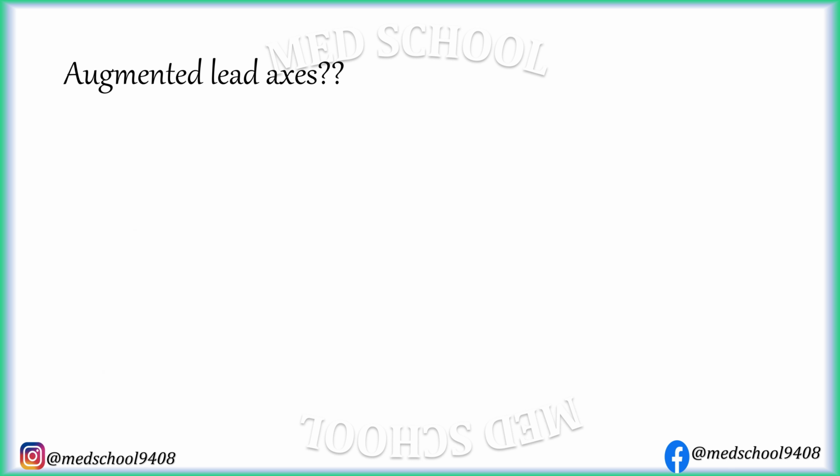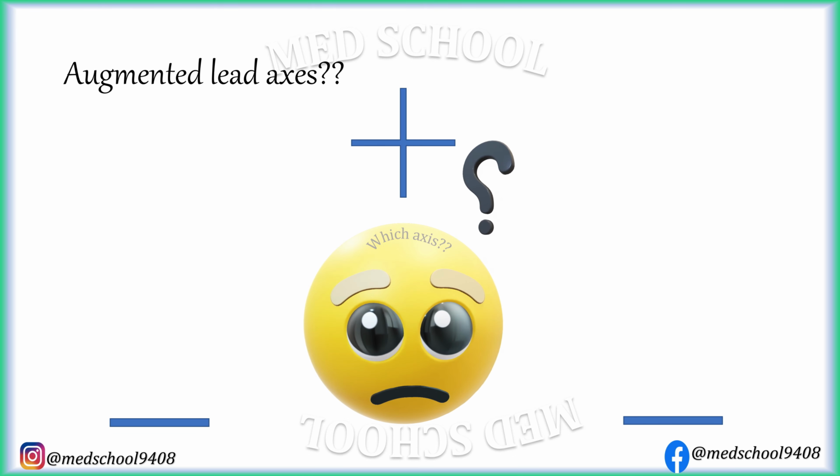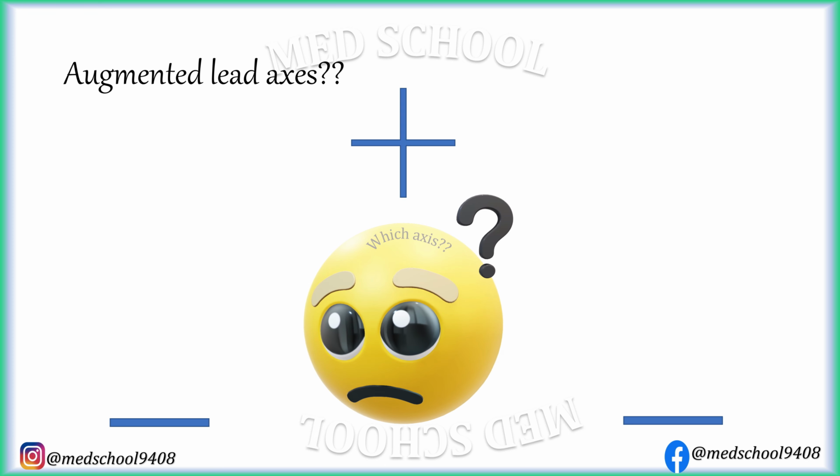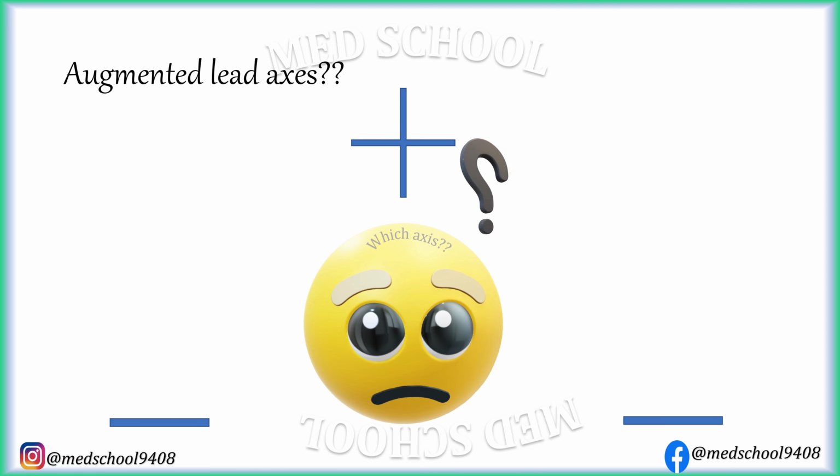Now let's determine the lead axis for augmented limb leads. But here we face a unique problem because only one electrode is acting as a positive pole, but there are two electrodes in combination acting as a negative pole. So which electrode should be taken as a point to draw the lead axis? Or if neither of them is to be taken as the negative pole, then which point is to be taken to draw the lead axis?